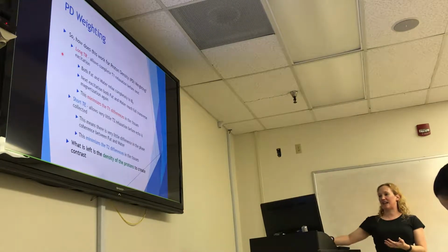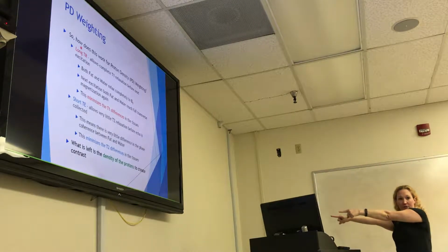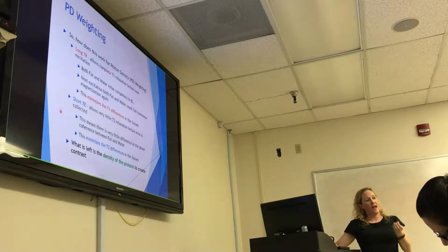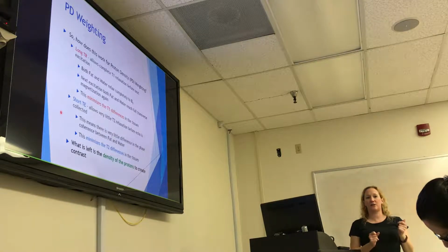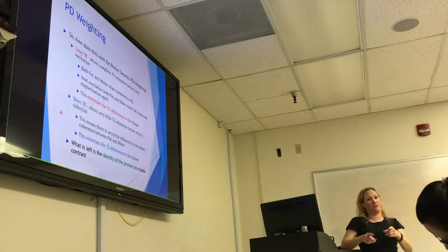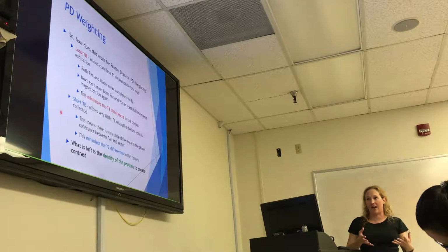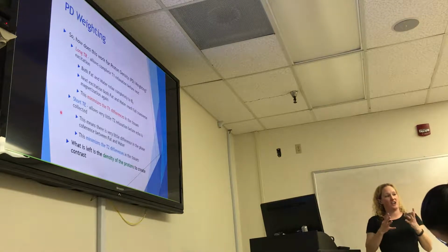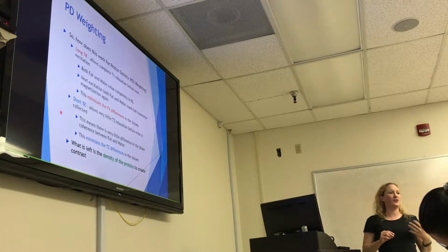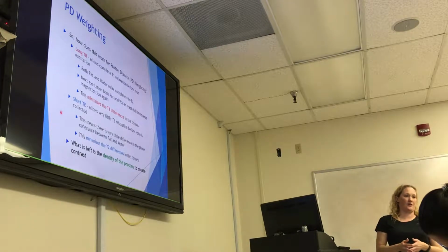So we're actually going to have that long TR, so we're waiting a long time to come back so that our protons relax back down, but we're gonna have a short echo time. We're gonna collect our echo very quickly because we wanna minimize how much T2 there is as well. So we don't want there to be a lot of dephasing that occurs. So we have that short TE. So we take our image very, very quickly. And then what you're left with is the density of the protons that are going to create your contrast.